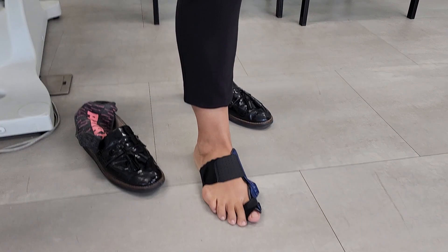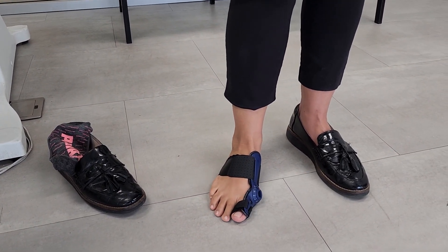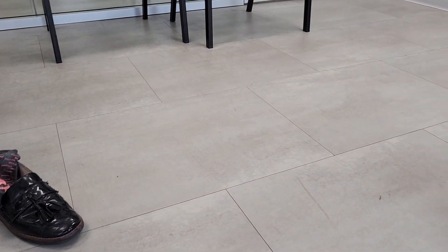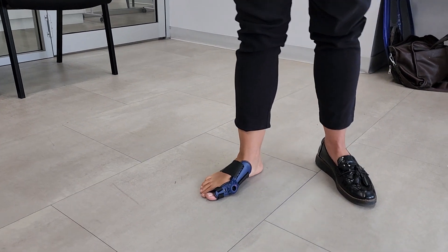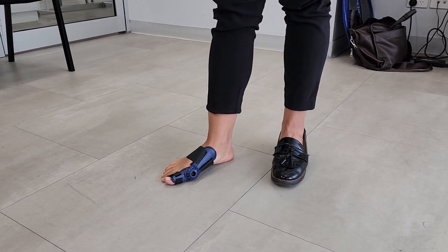How does that feel initially? It feels quite comfortable. And do you think it's restricting joint motion? Yeah, it just feels like a hard splint, but it's quite comfortable. All right, so let's see if it will fit into a shoe like that.